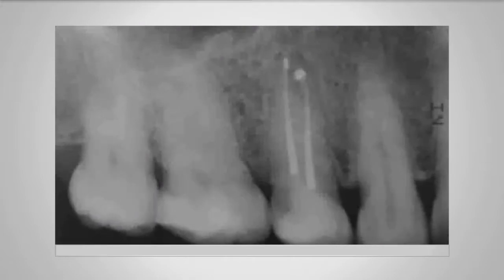Okay, another question that's come through. Can I give you some tips on how to use the Root ZX to accurately get the working length? Okay, you need to make sure there isn't lots of hypochlorite in the pulp chamber, so you need it to be fairly dry. Although they will work in a wet canal, they can't work in a soaking canal, so you need to have a little bit of moisture there, but not a lot.